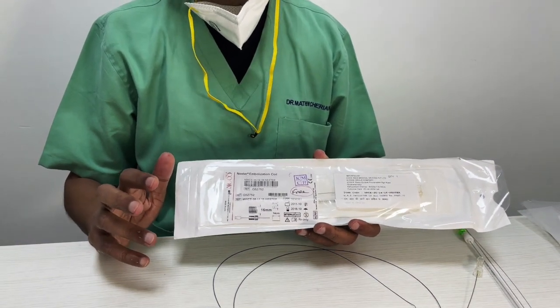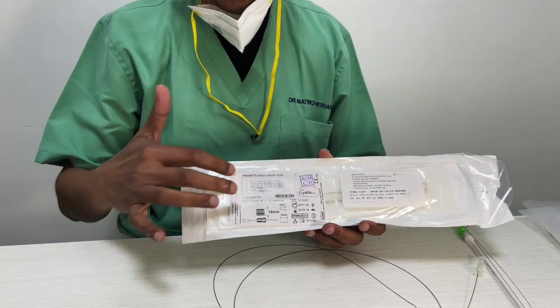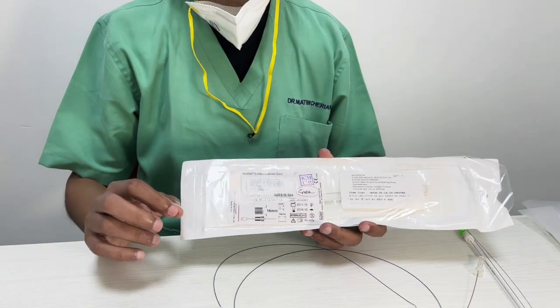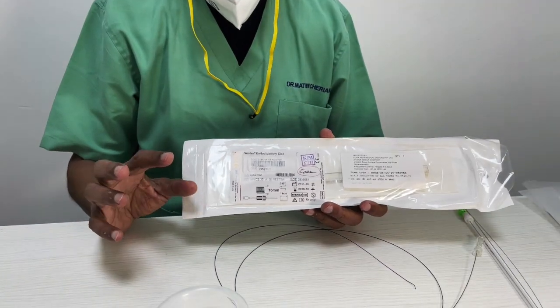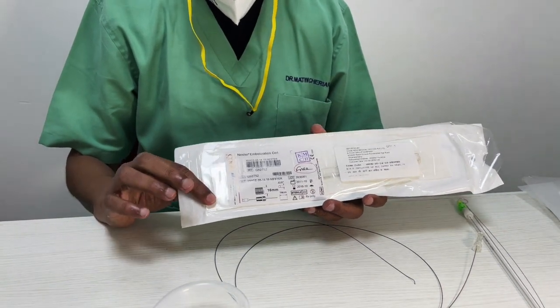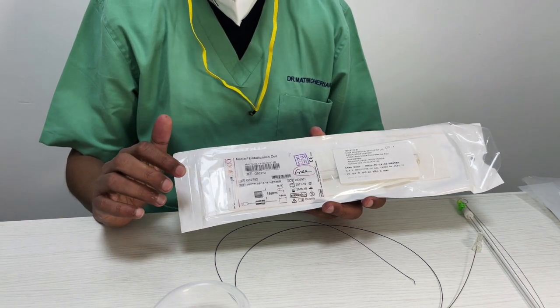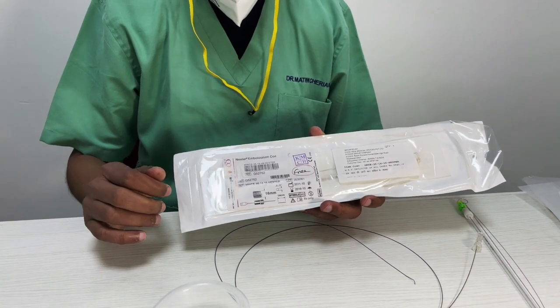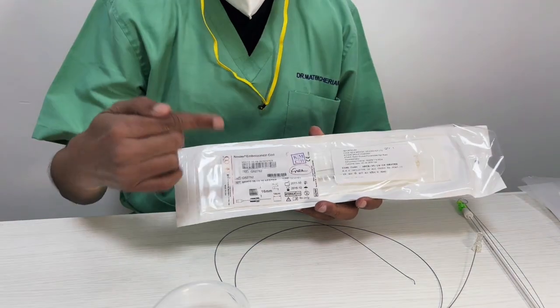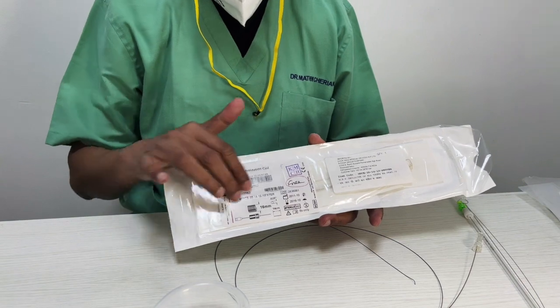Now, the original coils were developed by Gianturco, which he called Woolies, and these were the kind of coils he made. And the primary purpose of this coil was to occlude a vessel and nothing more than that. So let's have a look at how the first coil was basically made. Sometime back in a talk, I told you how you can make coils yourself by cutting the core and the outer coil out and pushing it out at an angle. We do not do that anymore because of the free availability of coils.